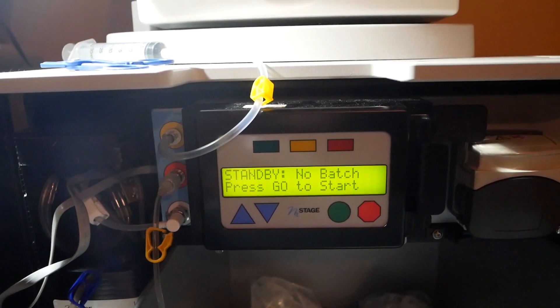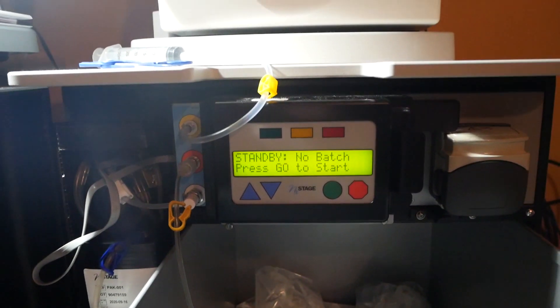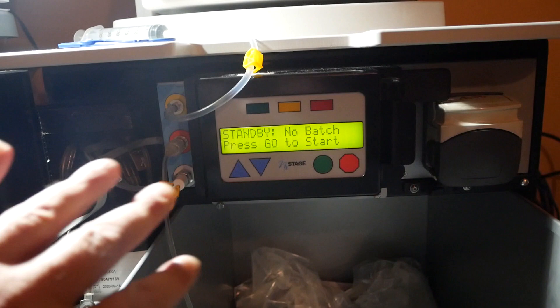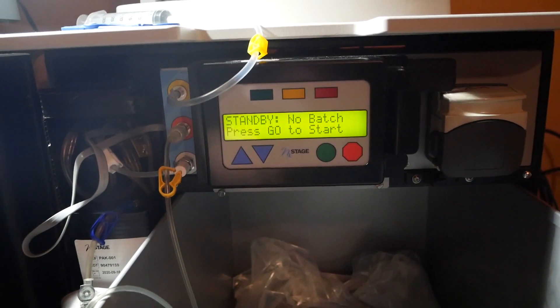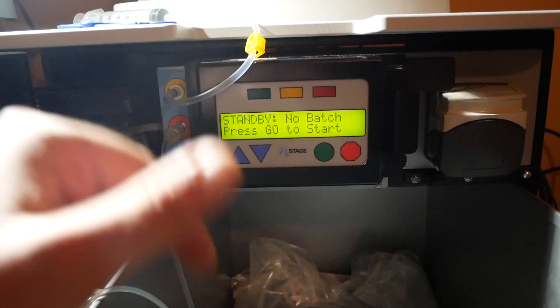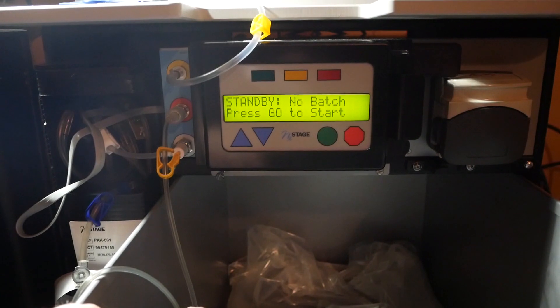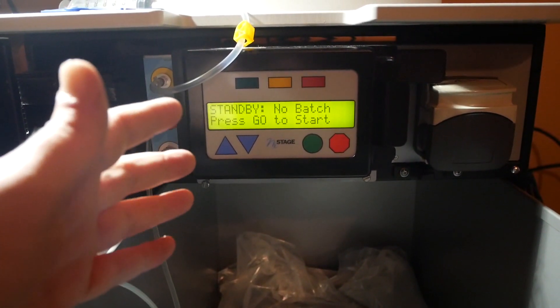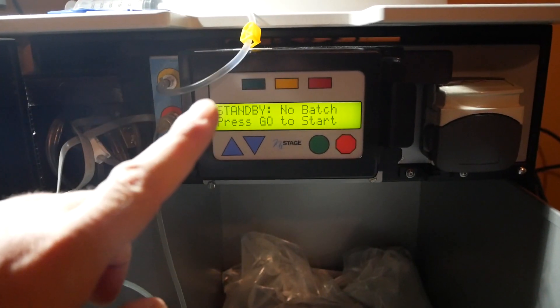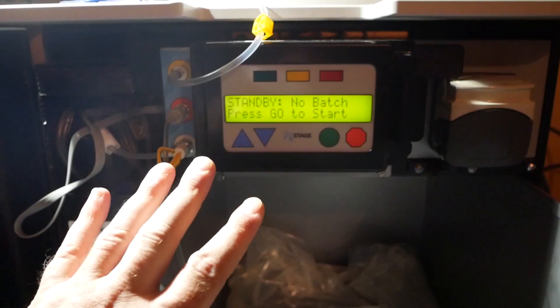It was waiting on you to close the door, so now it says 'standby, no batch, press go to start.' If you're going to make your next batch you can go straight in after your bucket is empty again. If you've got back-to-back treatments coming up, you can go straight into making the next batch.